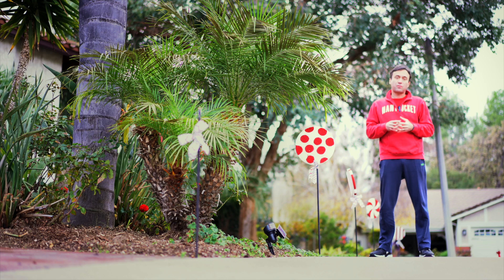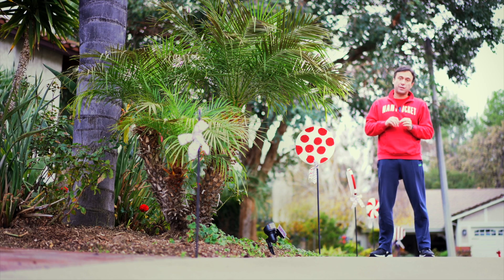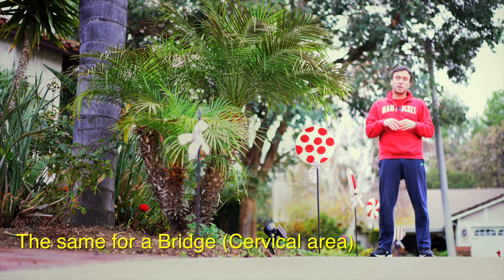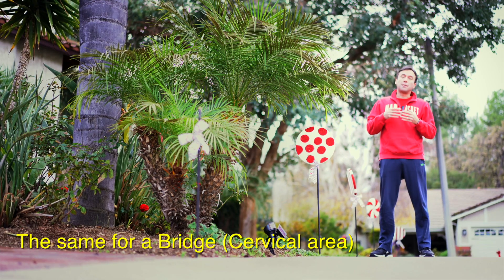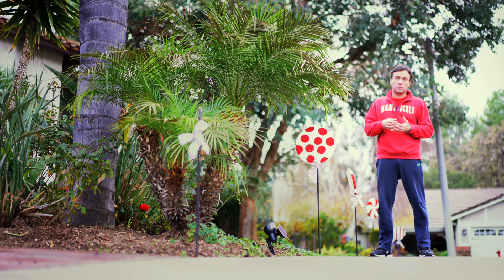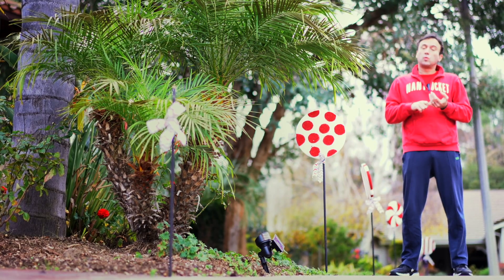I have found that in teeth with crowns, rather than placing the cold over the crown itself, bringing it to the cervical area where the crown meets the tooth gives the most accurate reading. Furthermore, in cases where there is a metal collar, putting the cold cotton pellet on the lingual aspect — whether on the lower arch in the lingual area or on the maxillary arch in the palatal area — would be a more accurate way of getting the cold to penetrate through the tooth.